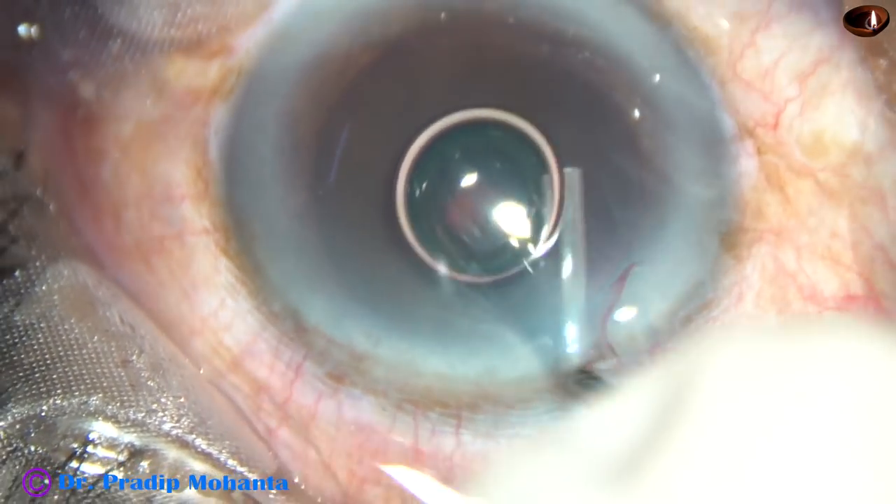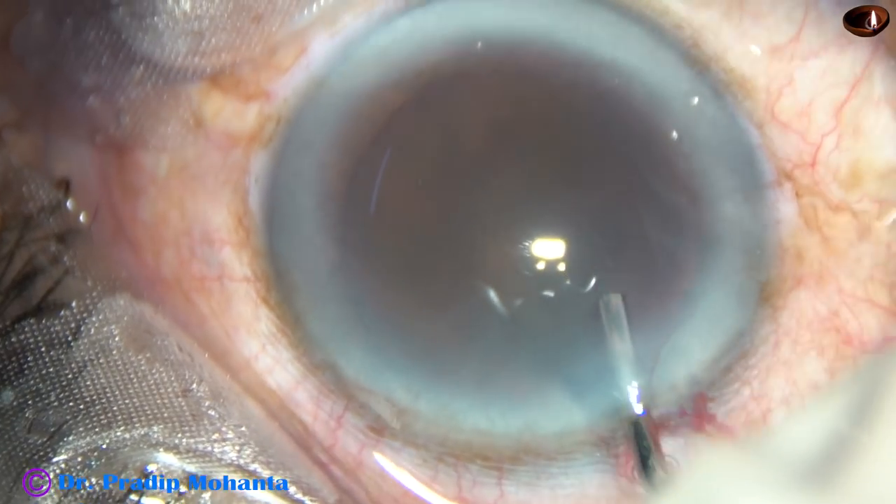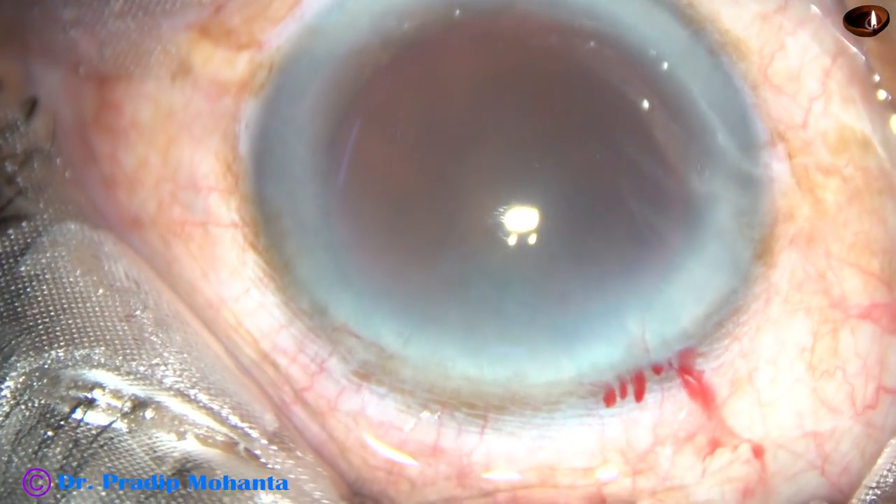This is a hard cataract. Nuclear sclerosis in this case is either grade 4 plus or grade 5.